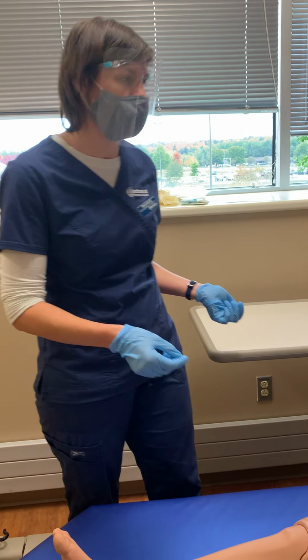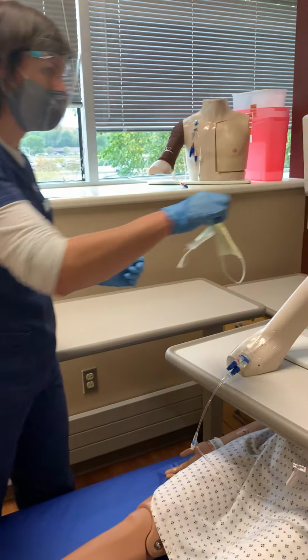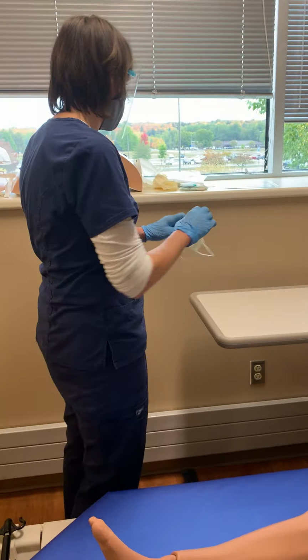As I mentioned before, lifespan modification for the PICC would be getting assistance if needed to maintain sterility. Oh, I'm sorry, Frances, let's get that mask out of your way. And she took it off, handed it to me, I put it in the garbage. I'm going to wash my hands again.